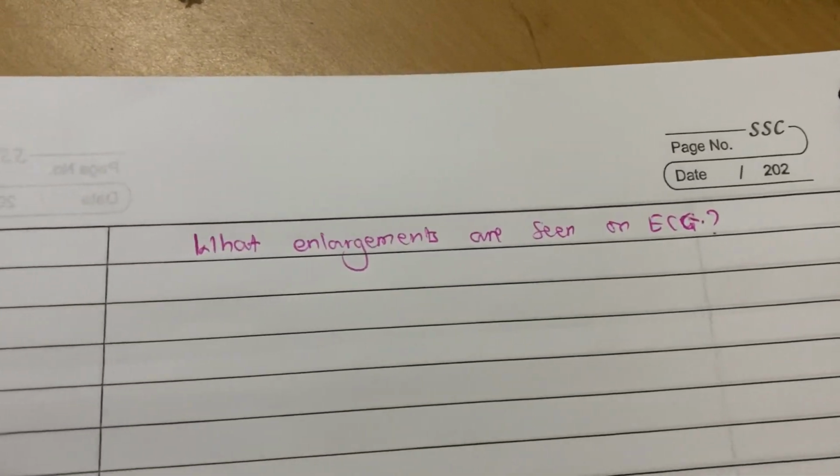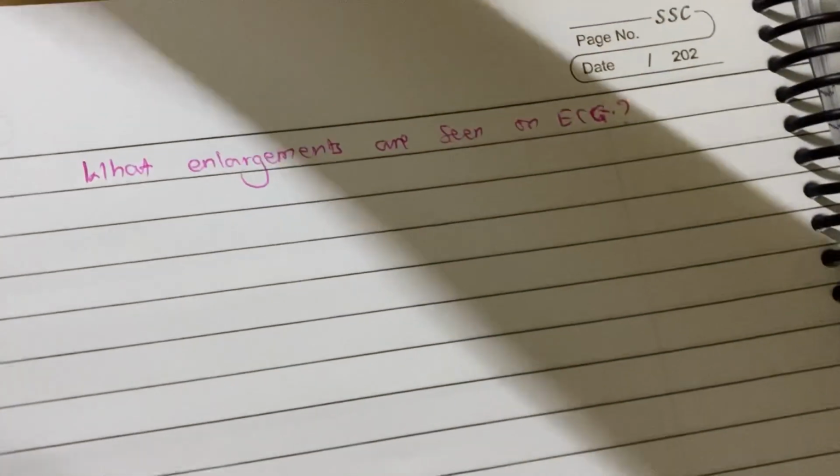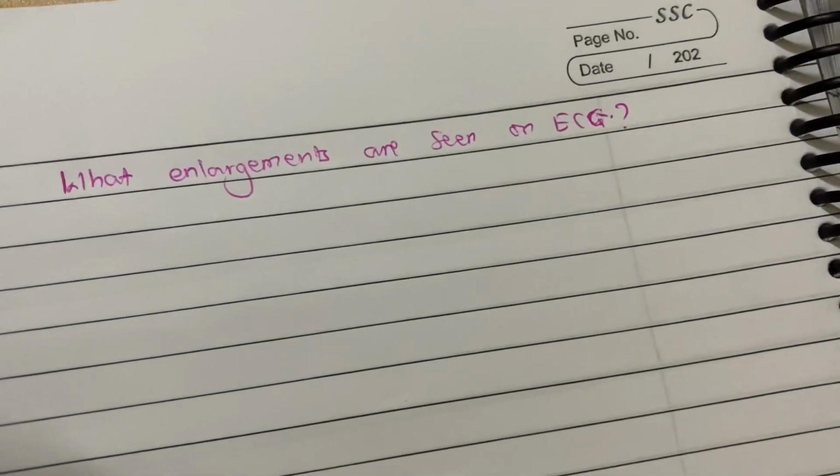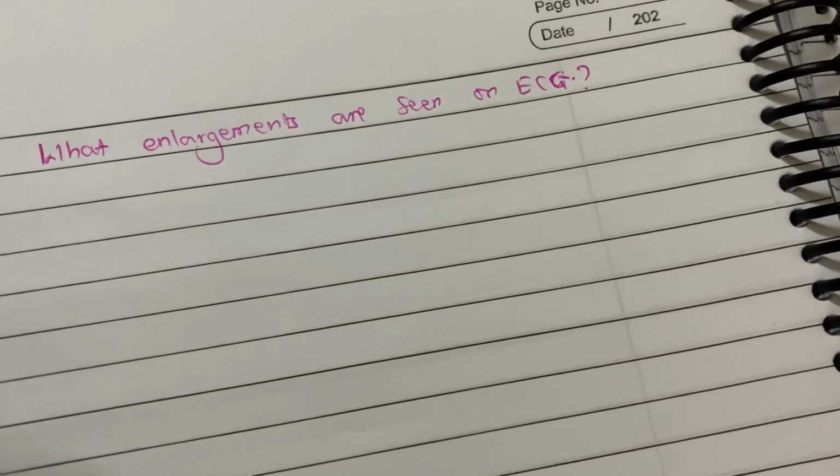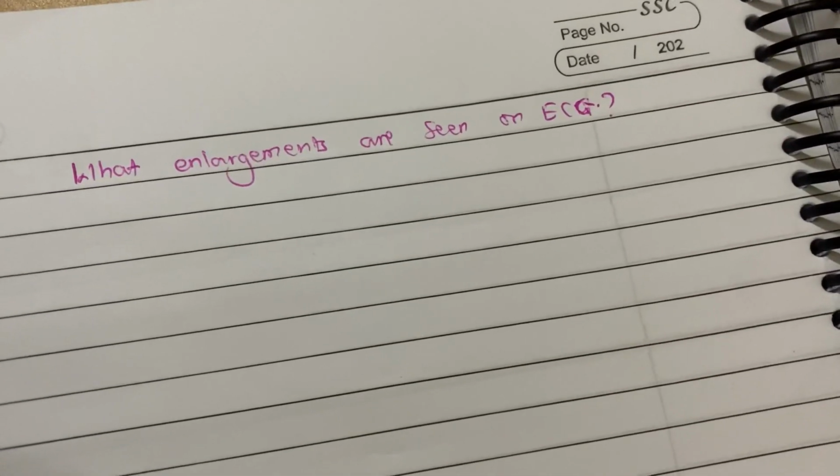So next is what enlargements are seen on the ECG. In the ECG, we can see enlargement of any chamber.